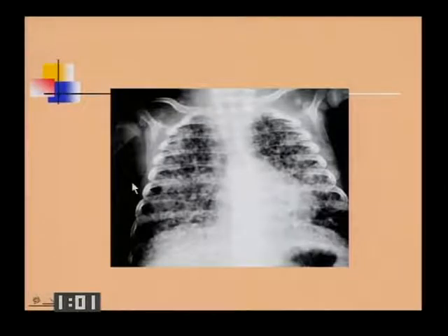That is actually miliary tuberculosis, and it can be acquired transplacentally, it can be acquired through a birth canal, it can be acquired through breast milk, it can be acquired through contact with an infected parent or caregiver, and this was miliary tuberculosis.